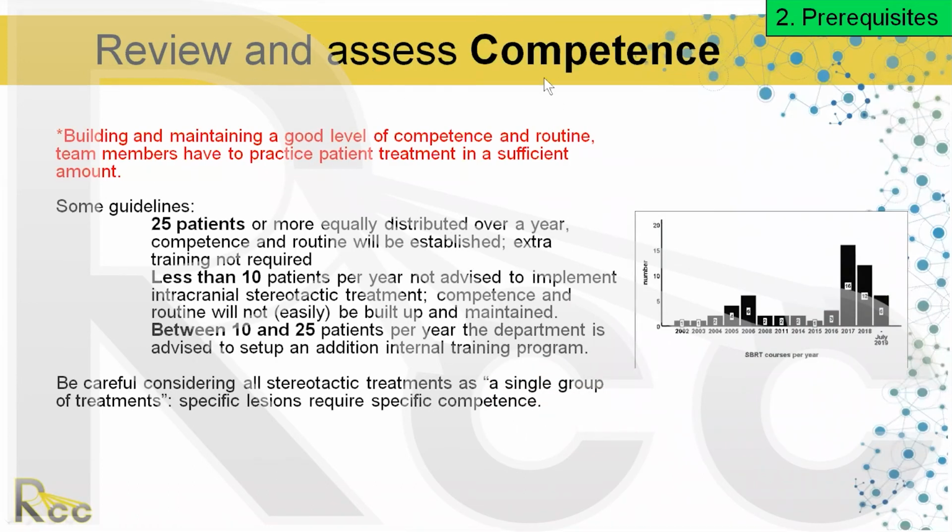So, reviewing and assessing competence. I mentioned before that you should have a minimum number of cases. This is at least how we approach it, and it's not my role to tell you how to practice. But if you're not doing 5 cases a year, are you just relearning it every time? And is that the best thing for the patient?